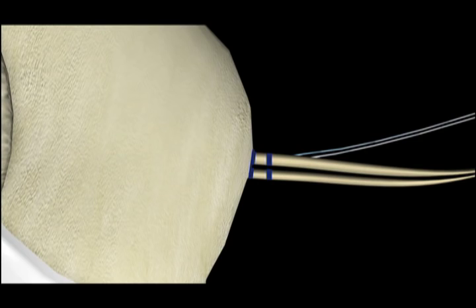The graft can be marked with a marking pen at 25, 30, and 35 millimeters away from the butt end to help track the amount of graft that has been introduced into the femoral tunnel.